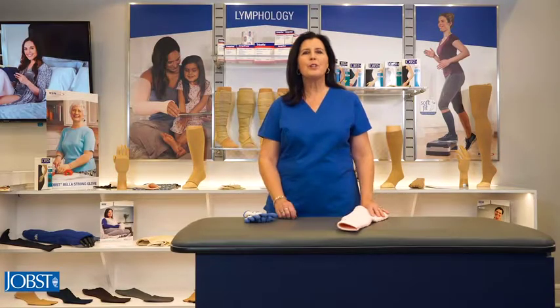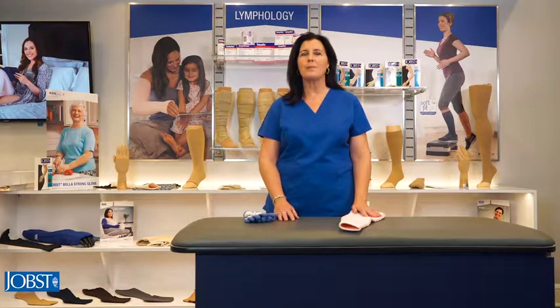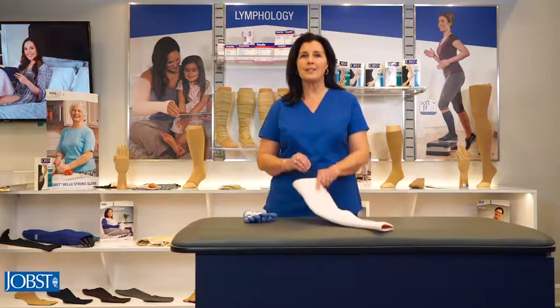Next, it's important you're in a comfortable position with enough space around you to don the garment. I'll now show you how to properly don the Jope's relaxed sleeve.